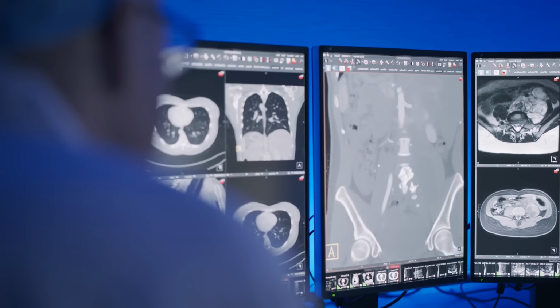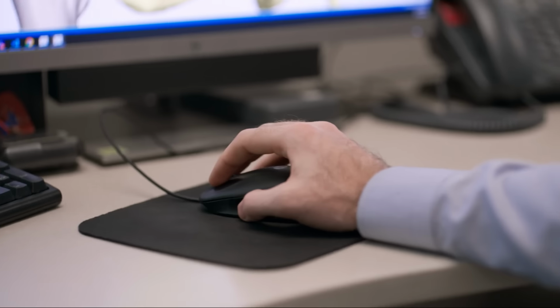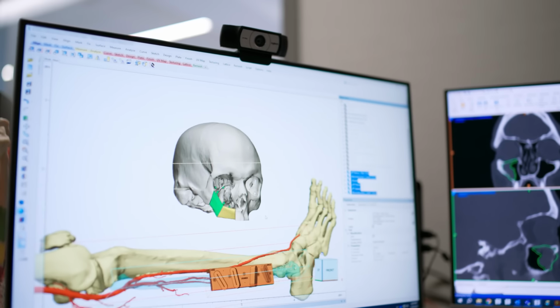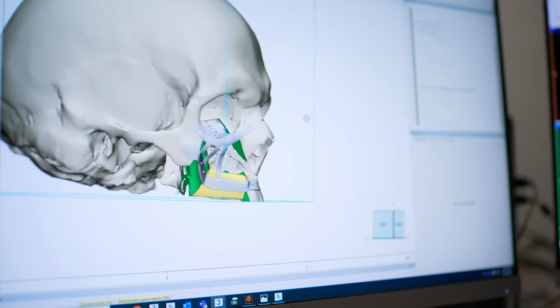90% of every patient that comes to Mayo Clinic will have some form of radiologic scan. Of that one scan, there might be 13,000 images. 13,000 images in 4 different phases, looking at arteries, veins, tumor, ureter, all of this information. An engineer is going to have to segment out every slice in order to make a 3D printed model. And we probably do about 3,000 models per year.